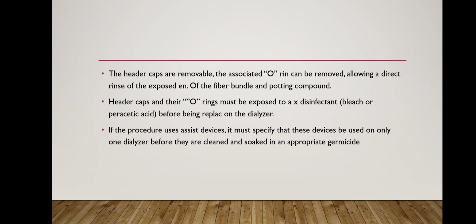Next, the header caps are removable and the associated O-ring can be removed, allowing a direct rinse of the exposed fiber bundle and potting compound.